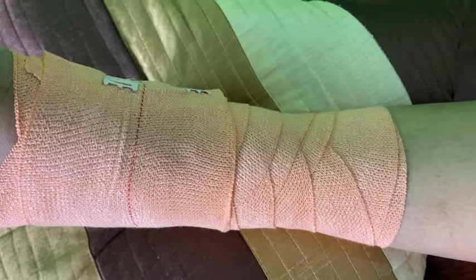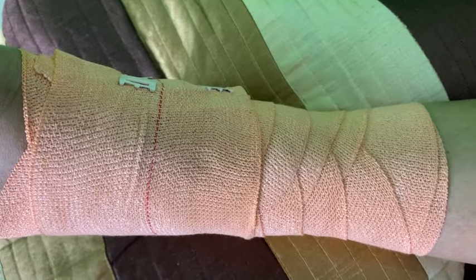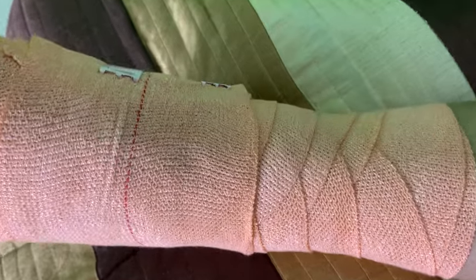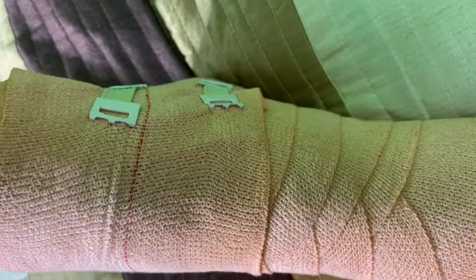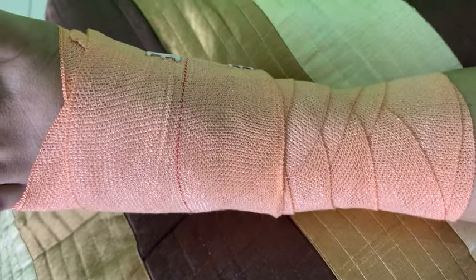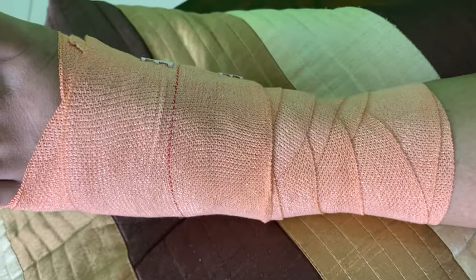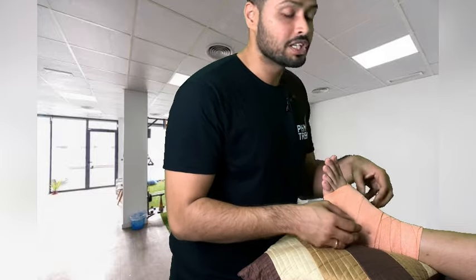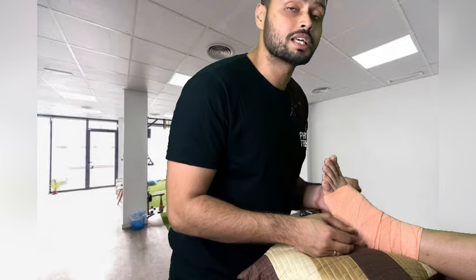The ankle bandaging for ankle sprain on the lateral side is now completed. If you have a look at it, you can see the overlapping design of the Crepe Bandage. Nowhere should you be able to see the red lining — it is only present on the last wrap, which means I have accurately covered half of the Crepe Bandage each time.